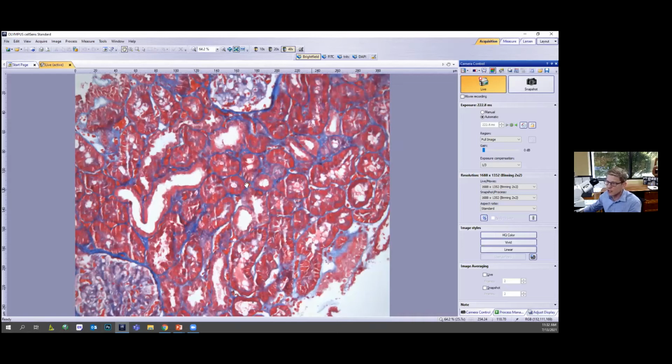You see just a little bit of blue, but when a kidney begins to have chronic or long-standing injury, you begin to develop scar. So you develop fibrosis, and this blue would expand, and you would begin to see more of the blue than you do the red. This would be a kidney in a more scarred state. But this one that I'm showing now is normal.